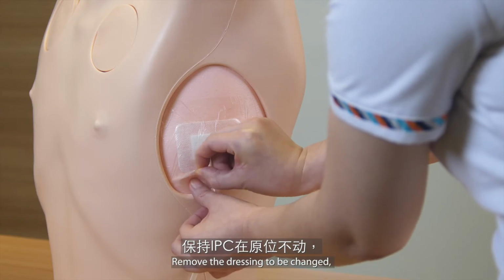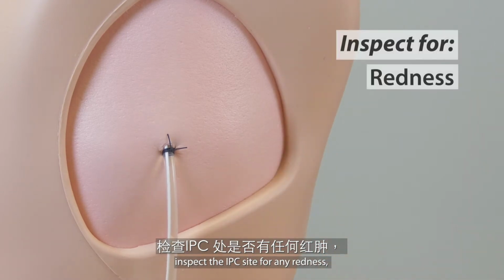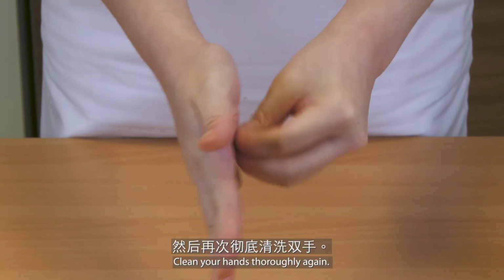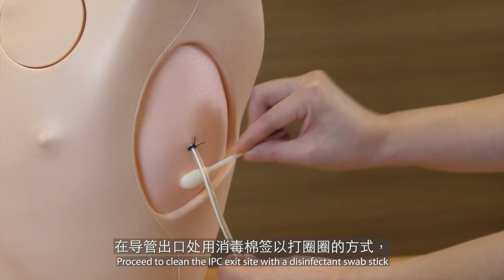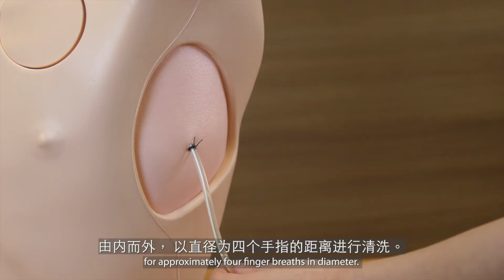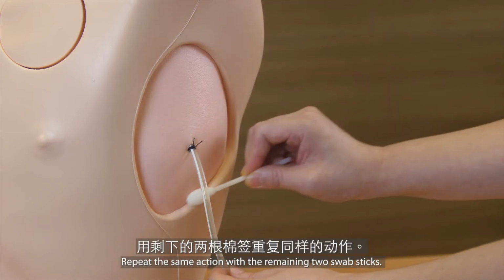Remove the dressing to be changed while holding the IPC in place, and inspect the IPC site for any redness, swelling, fluid discharge, and loose or broken stitches. Clean your hands thoroughly again. Proceed to clean the IPC exit site with a disinfectant swab stick in a circular manner with an inner to outer direction for approximately 4 finger breadths in diameter. Repeat the same action with the remaining 2 swab sticks.